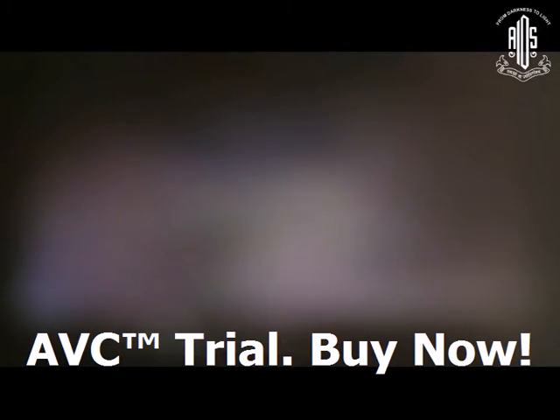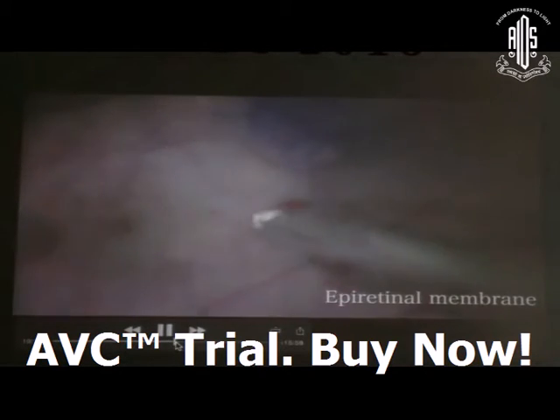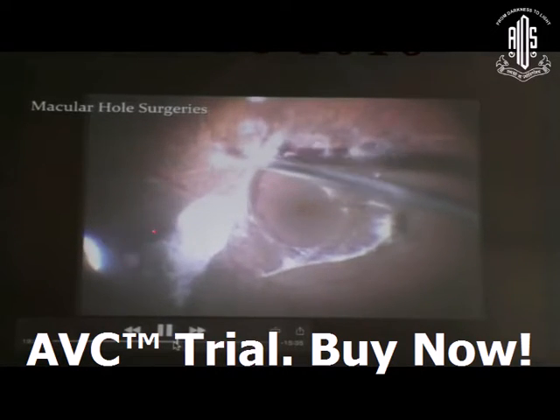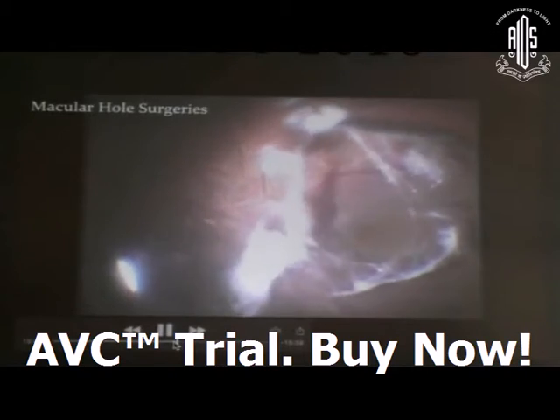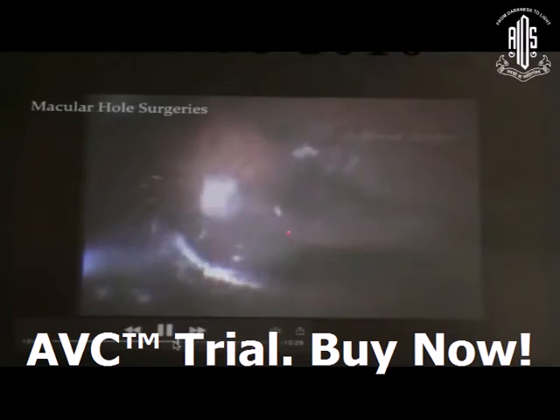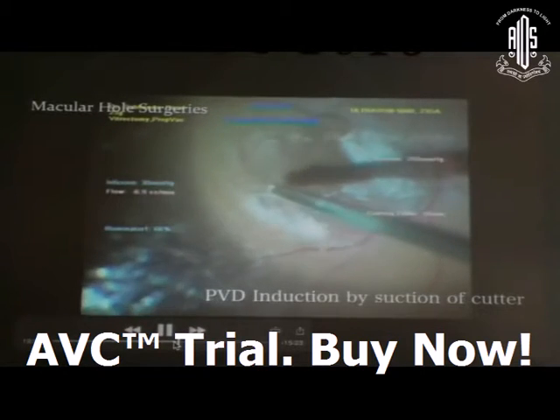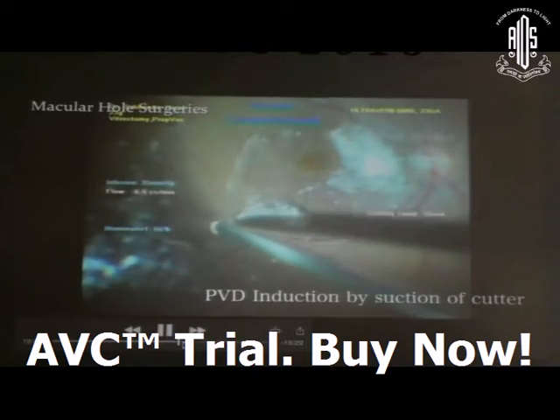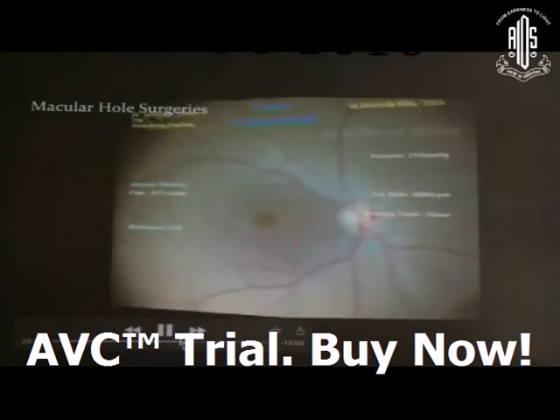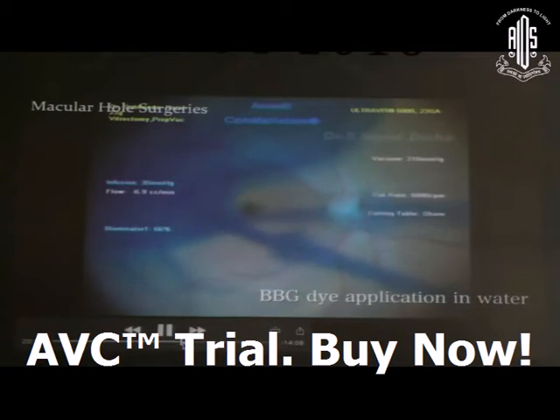The second macular situation is macular hole surgery. PVD induction: the most thickest part — you can do it with the suction of the cutter only, or you can use the silicone tube backflush needle. After PVD induction, stain the ILM by injecting BBG dye, which can be applied in water or under air.